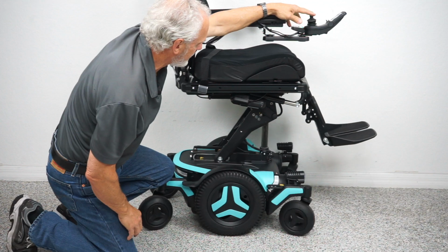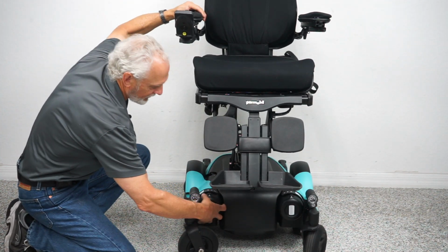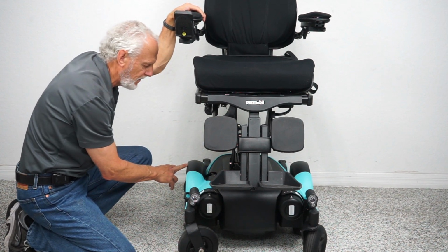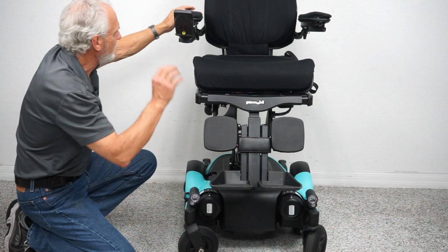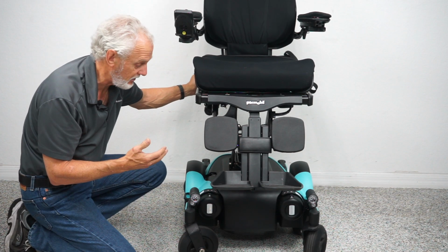Okay, let me turn the chair around so you can see the motors. These are your motors right here in front. Okay, so these motors go from the front all the way directly to the wheel. No chain, no belts. This is why these motors are so quiet. They go directly to the gearbox. If I want to push this chair, well, I can't push it because it weighs probably about 450 pounds.